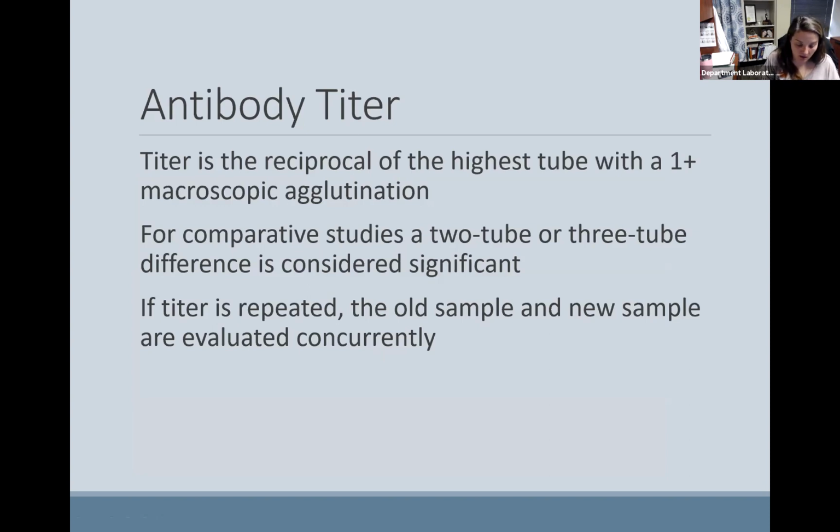So when you are doing maternal studies and a pregnant female is identified to have an antibody, we always have to titer that antibody. All right, so we want to establish a baseline titer. Usually if mom has a circulating IgG antibody, she is considered high-risk pregnancy. She will probably have more frequent visits to her OBGYN, and each time that she visits, they are going to draw her blood. And we will continuously follow the formation of that antibody by performing a titer.